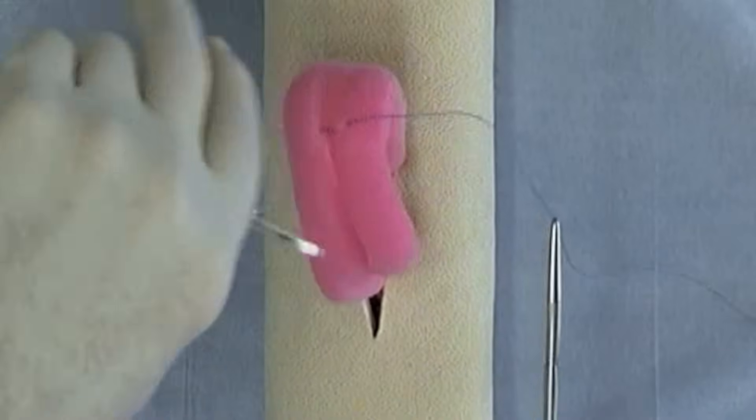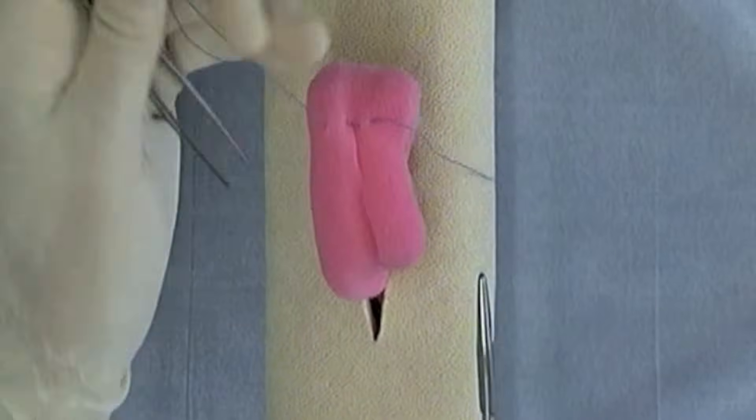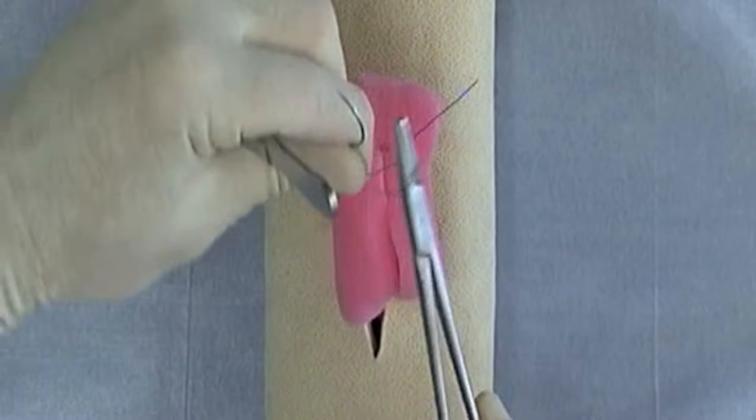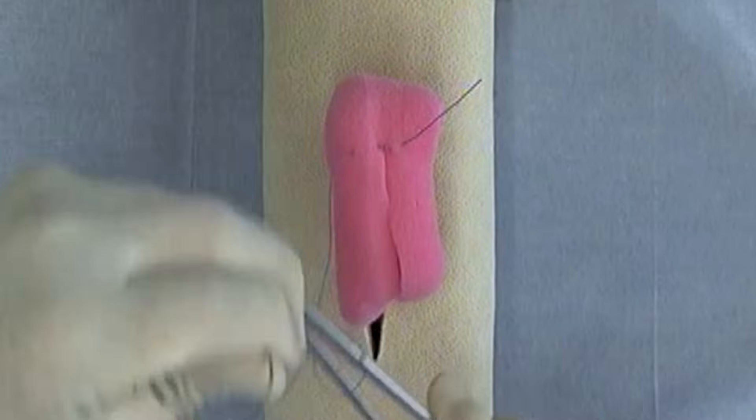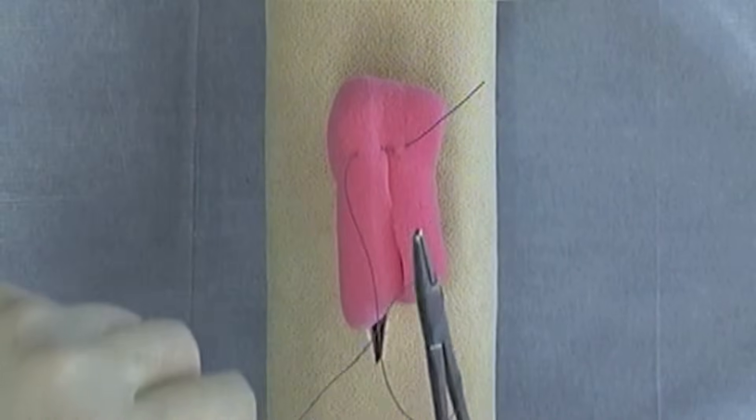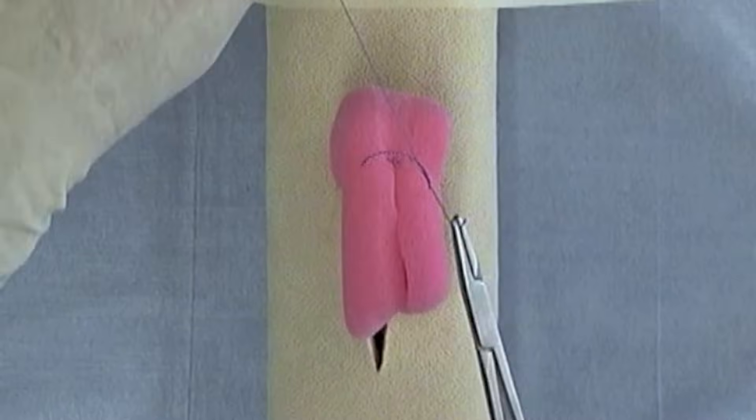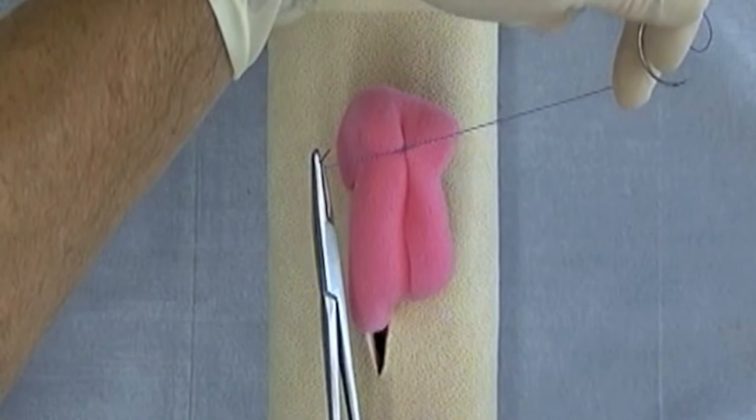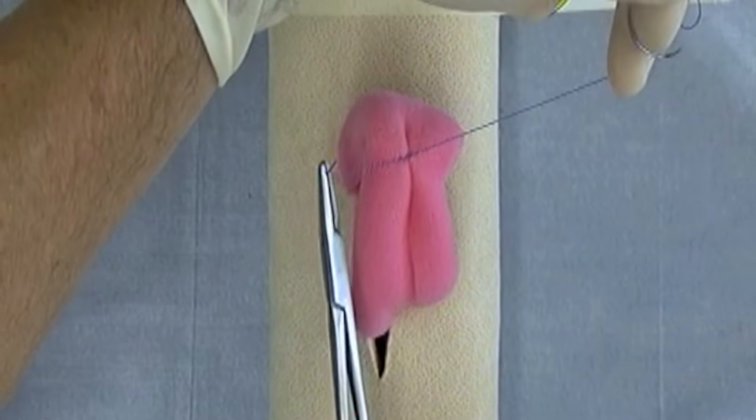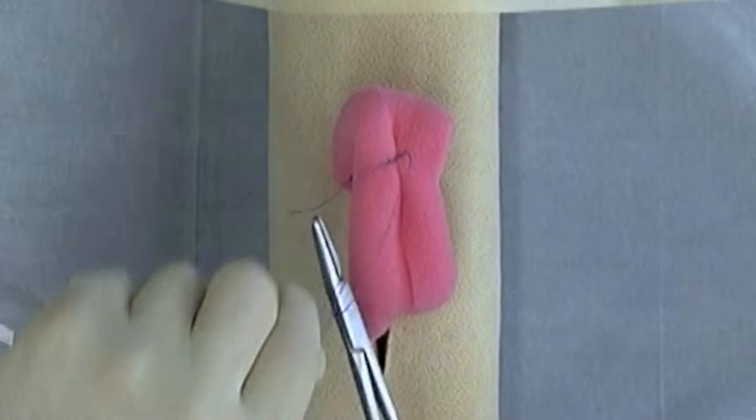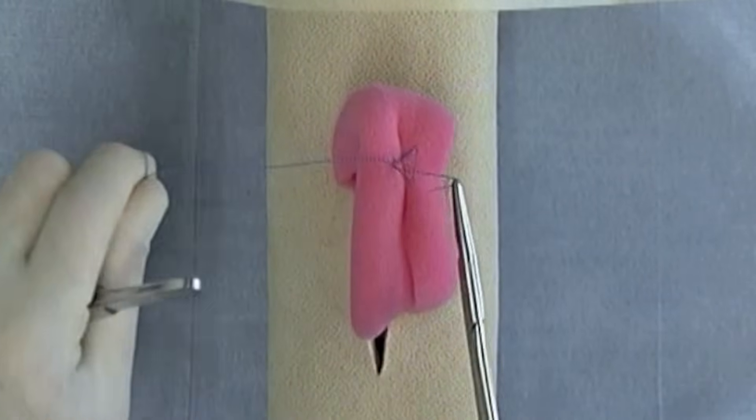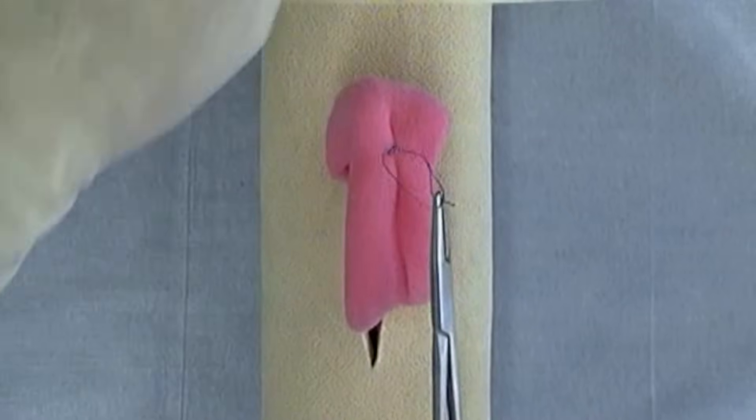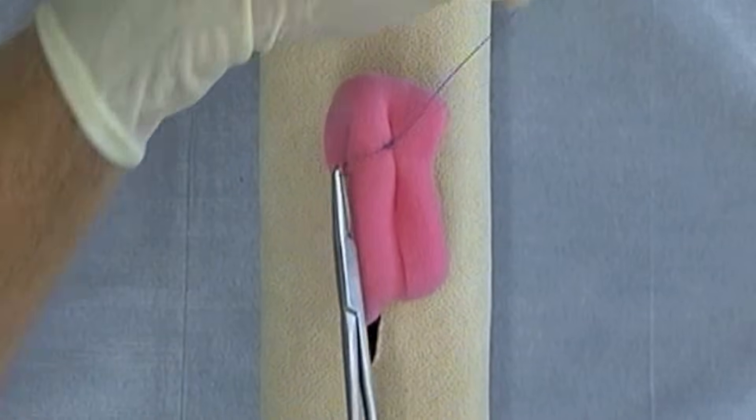This is a non-penetrating suture. Notice I'm going to grasp and gather my suture, and when I tie, and I'm going to tie it purposely with a surgeon's knot to hopefully achieve the inversion that I intend with the suture pattern. Recall that the Lembert and some of the other intestinal suture patterns are inverting suture patterns, and what you're trying to achieve here is to get serosa to serosa contact.